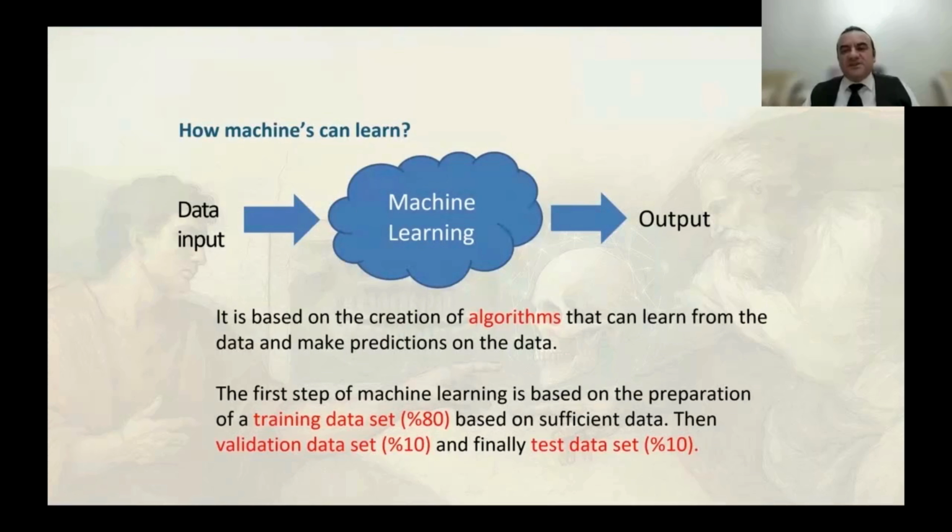But how can these machines learn? It's based on the creation of algorithms that can learn from raw data. If you would like to teach a machine, first we need to put data into it. And the first step of machine learning is the preparation of this data.